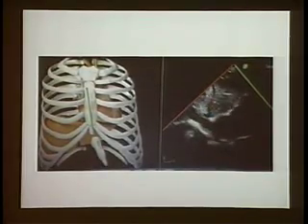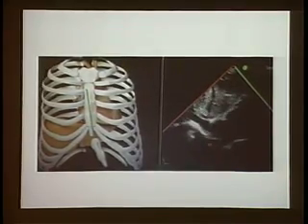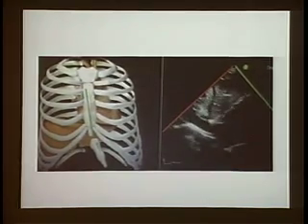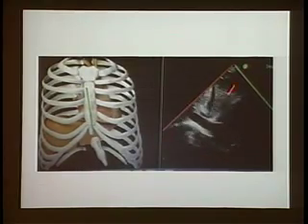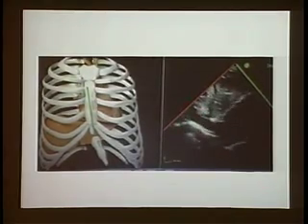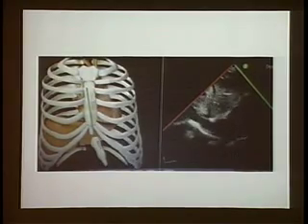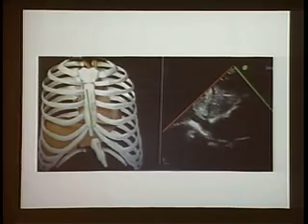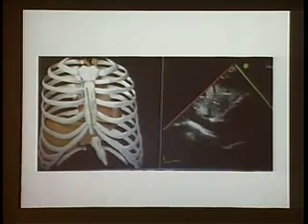And the reason we like to do this modified vision of the IVC is we try to assess volume status. And I'm going to talk about that a little bit more in the next lecture. But just by rotating the probe 90 degrees and aiming a little bit towards the liver of the patient, you get this modified view. But very simple. Subcostal, you get your modified 4-chamber view. You move 90 degrees towards the ceiling, and you get this view. This is the subcostal IVC view.